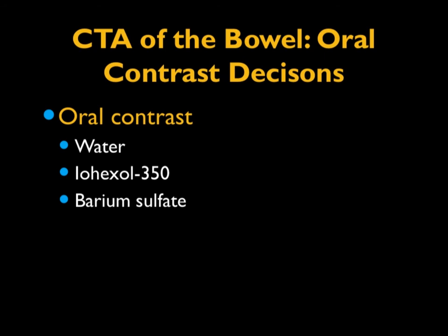In terms of oral contrast, I mentioned we can give neutral, which is water, or we can give positive, which is iohexol in solution. Now, we definitely give positive if we can't give IV, and we definitely give positive if we're looking for a fistula, in this case, a patient with pneumoperitoneum. We also give positive at times in oncology patients to better define involvement of the bowel loops, which can be problematic without any oral contrast material.